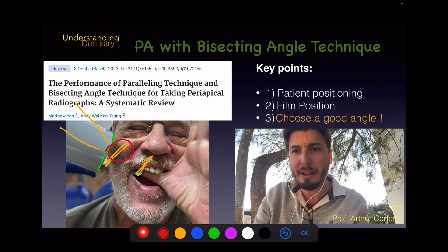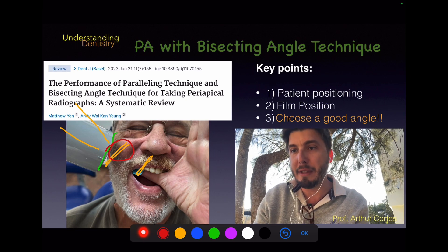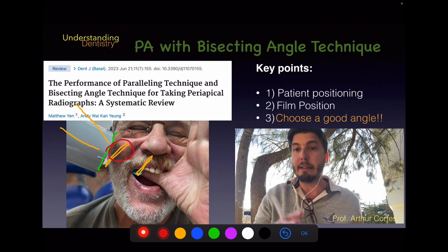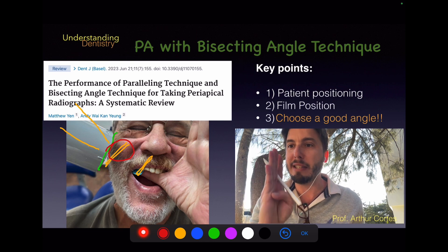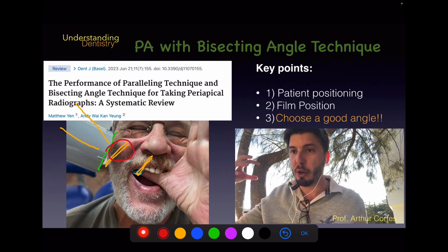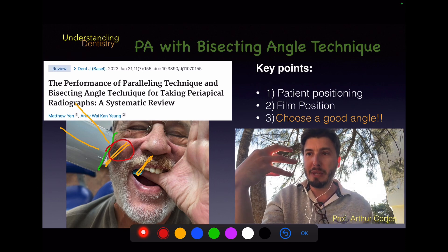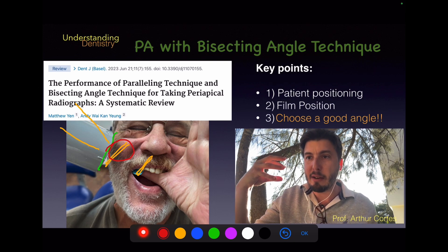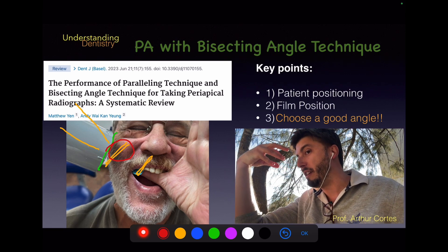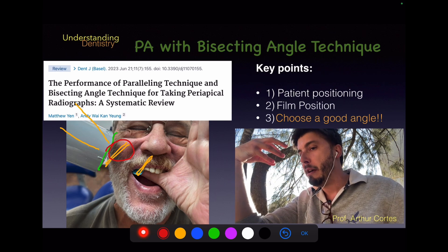To avoid zygomatic bone superimposition, tilt the base of the x-ray source slightly downward and the top slightly upward — the adjustment is very small. This is especially important in the posterior upper region, which is one of the most challenging. For the horizontal angle, it must be parallel to the mesial and distal surfaces of the teeth — check the interproximal surfaces and align parallel to them.